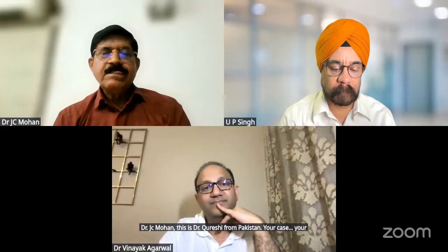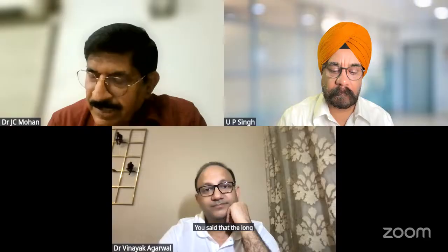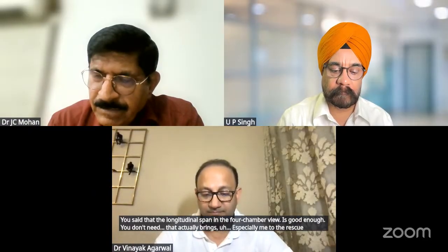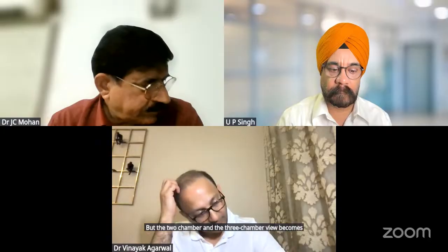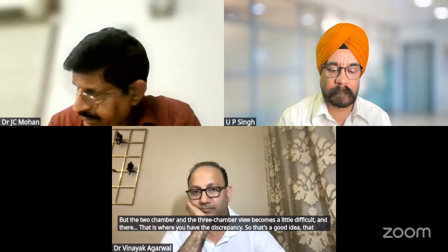Dr. Mohan, this is Dr. Qureshi from Pakistan. Yes, your case is excellent. There are 2 points which I want you to clarify. Number one, you said that the longitudinal strain in the 4-chamber view is good enough. That actually brings especially me to the rescue, because normally what I find is that the 4-chamber view is very well taken, but the 2-chamber and the 3-chamber view becomes a little difficult, and that is where you have the discrepancy. So that's a good idea that you only use the 4-chamber view.